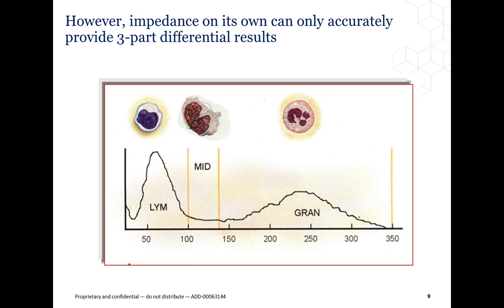Abnormal cells may appear as transitional populations that overlap the 3 normal populations, such as NRBCs, platelet clumps, giant platelets, or unlysed red cells, to name a few. When abnormal cells are detected, these need to be resolved with an alternate method, such as a microscopic slide review or 100-cell manual differential.